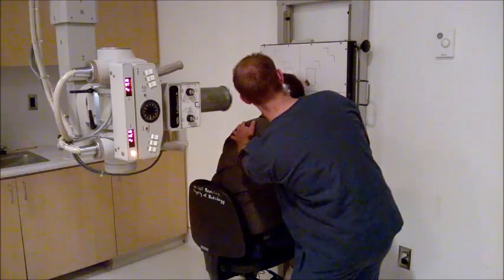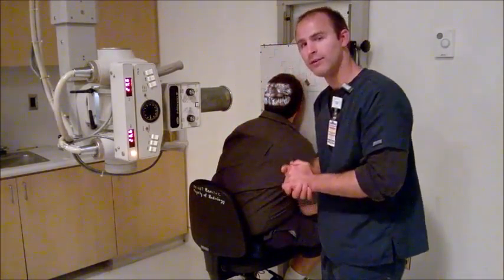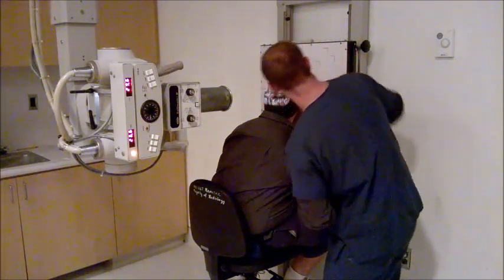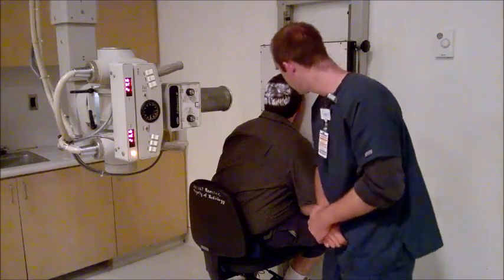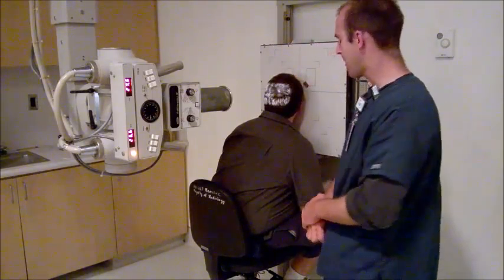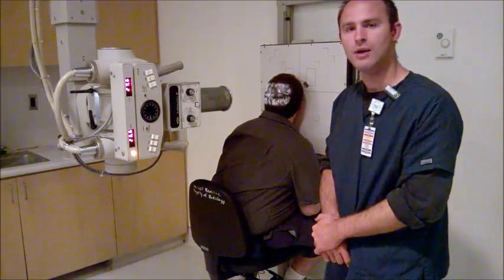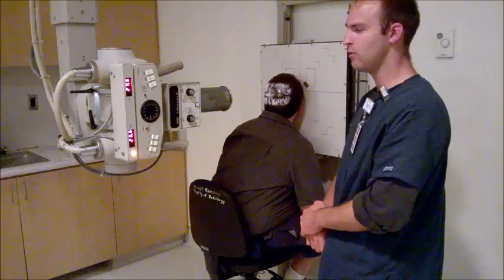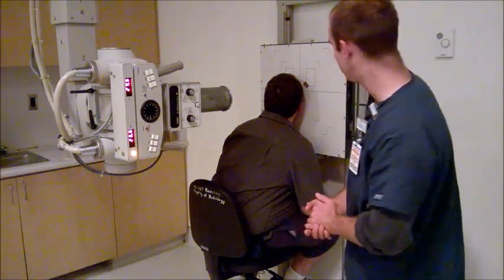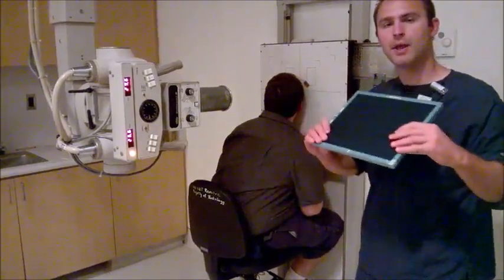Right, move off to the right a little bit, and this time it's unilateral, so one-sided, not both sides, not bilateral. Put your marker, right marker, there we go, and it'll be pretty much the same technique as the Waters, because it's diagonal through the head. So you would put 70 kVp at 25 mAs, and I'll of course check my IR and read it.